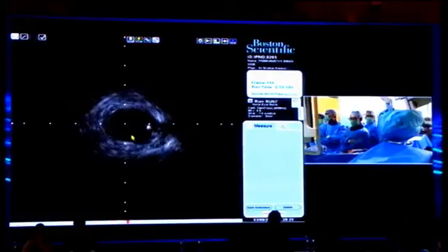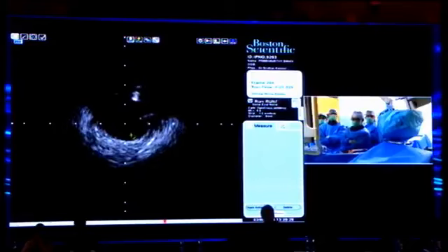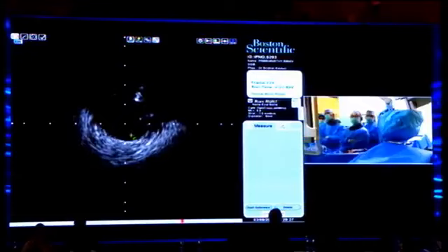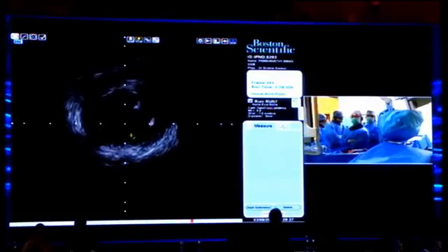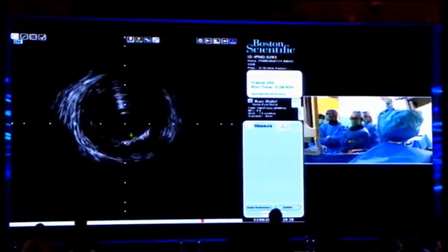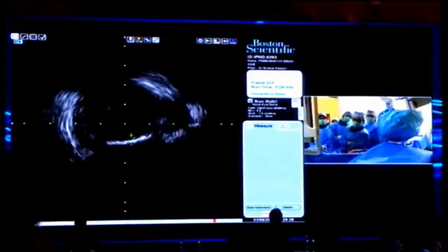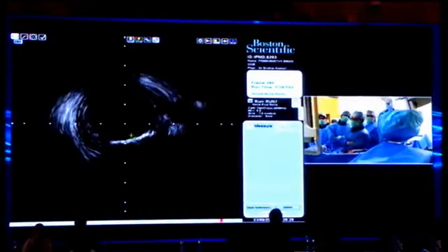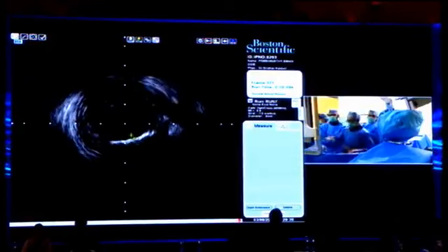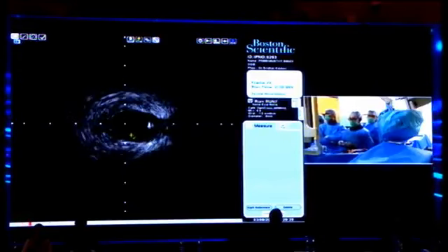Yes, so the vector, this direction is the same as the center of the distal circumflex, I think. Do you agree? Yes. But unfortunately, the distal part is unknown. But from this IVUS study, it seems like maybe the correct way is to advance the Gaia second guide wire. So I believe this Gaia second wire passes through the CTO and exits via the intima.